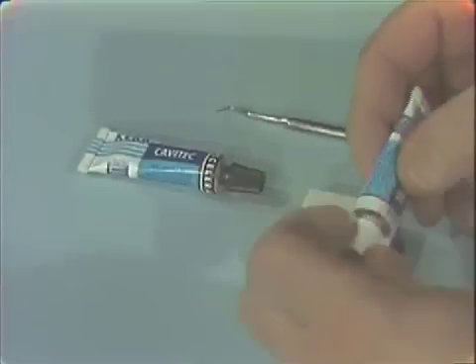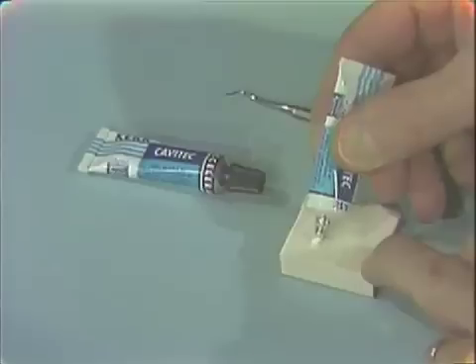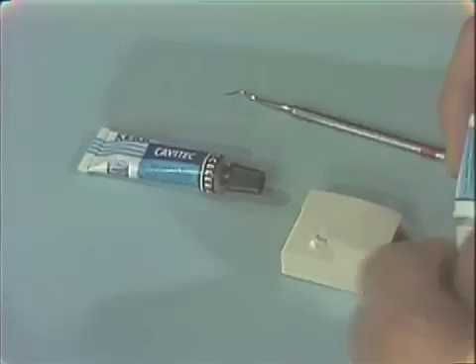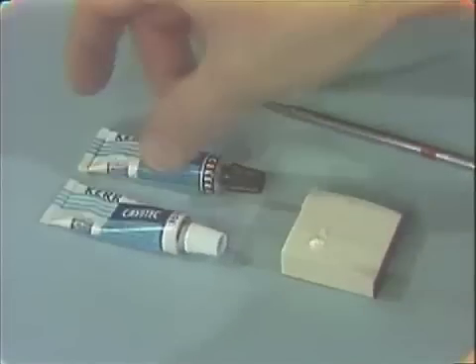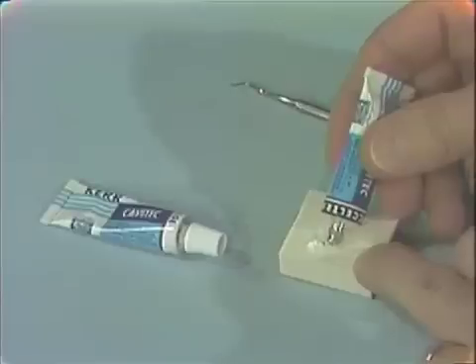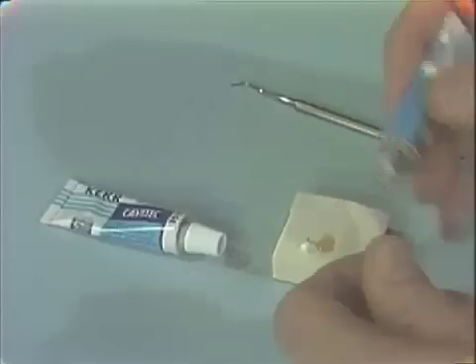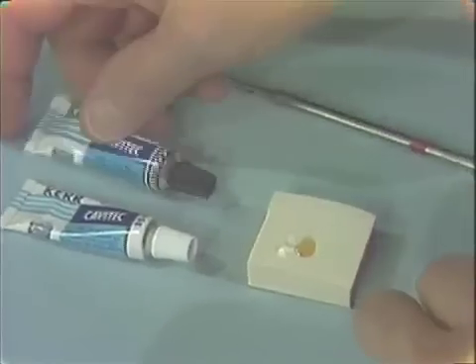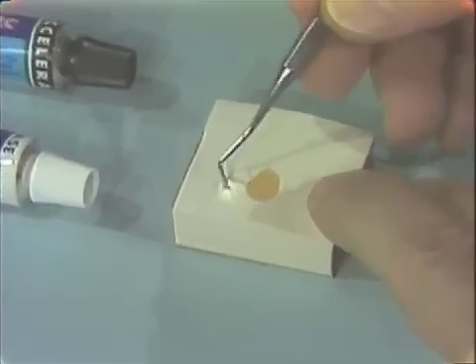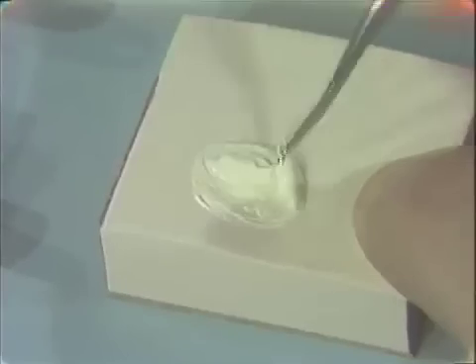The base form of the material is first dispensed in approximately a two millimeter diameter portion. The accelerator is proportioned in a similar volume. With a clean spoon excavator, the base and accelerator are mixed together to a uniform color.